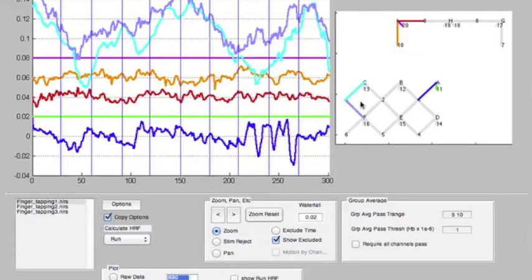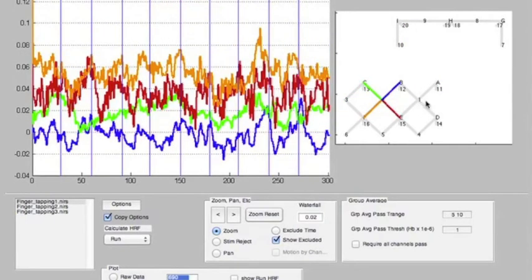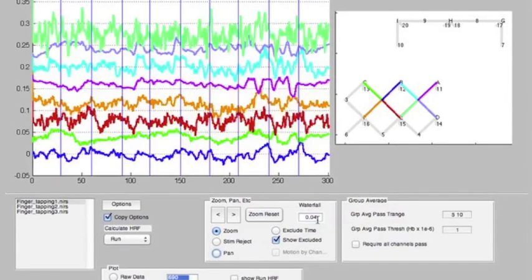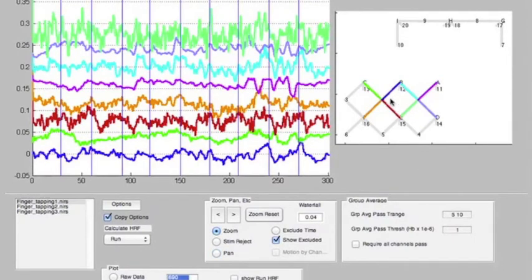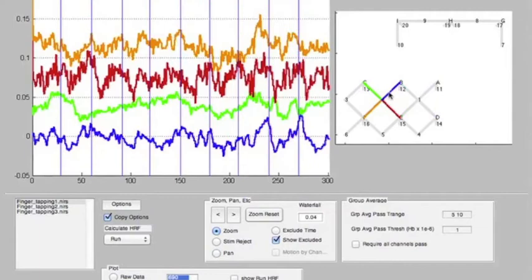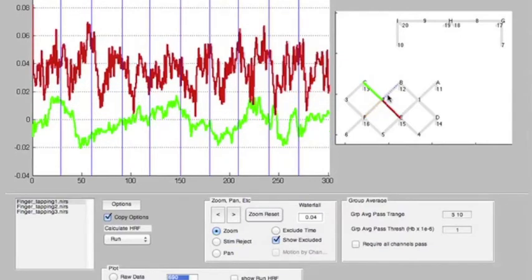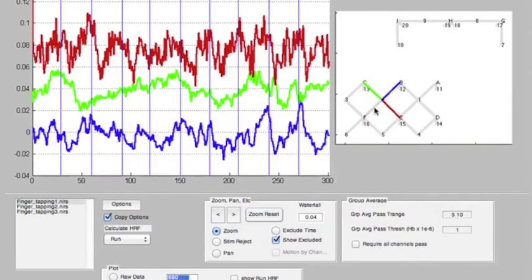I've shown you what happens when you shift-click—you get multiple channels of data. You can use the waterfall to separate those channels. I've also shown you that you can right-click to hide different channels of data, and then right-click again to bring those channels back.